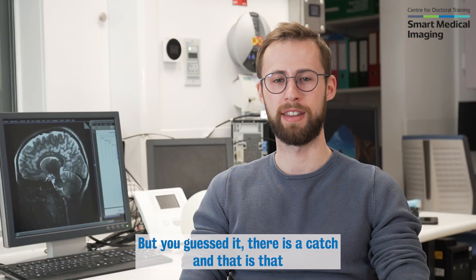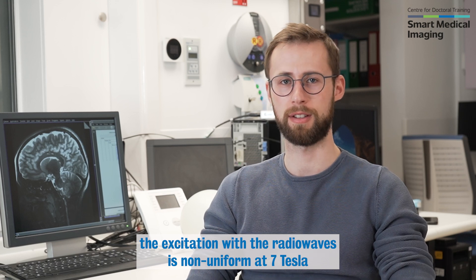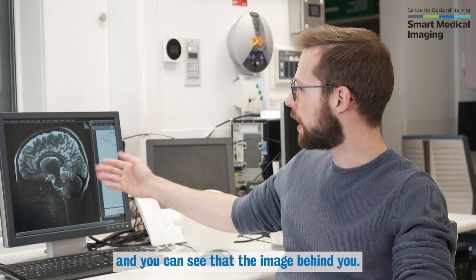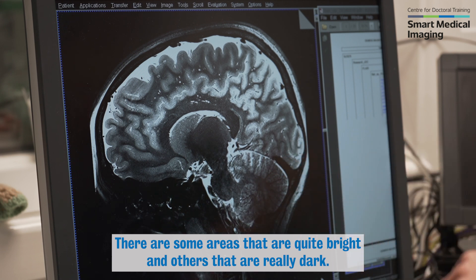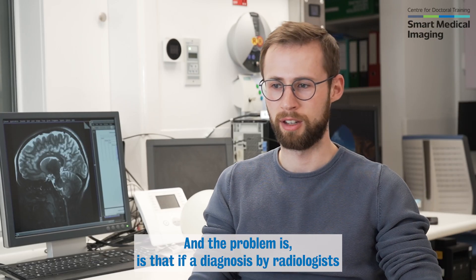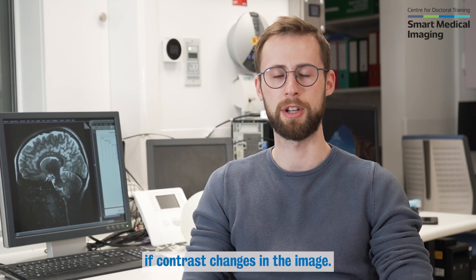But there is a catch, and that is that the excitation with the radio waves is non-uniform at seven Tesla. You can see that the image behind me — there are some areas that are quite bright and others that are really dark. The problem is that if a diagnosis by radiologists is based on contrast, it can't be done if contrast changes in the image.